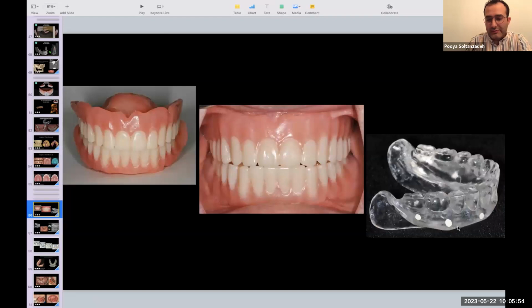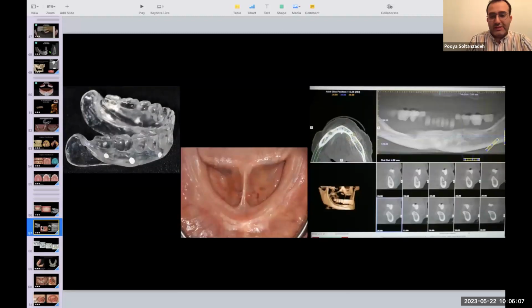And this is like they made a denture with the fiducial marker, which is like a gutta percha, but you have to make sure when they do the CT scan, these things are inside the patient's mouth as mutual points, so they're able to superimpose it when they want to design or plan it, right? And this is how it's gonna look.